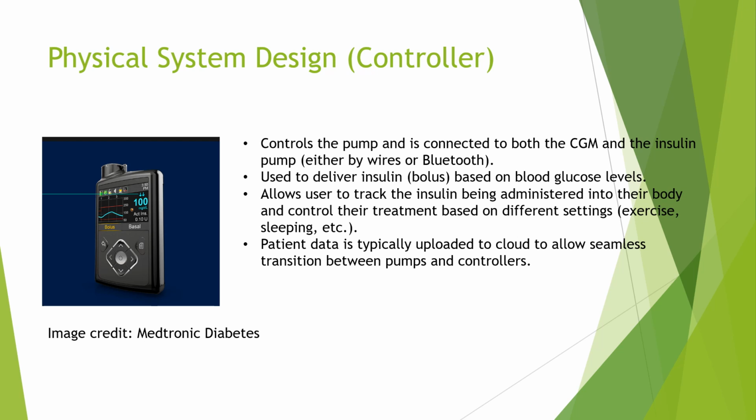The controller is this device. It is connected to both the insulin pump and the continuous glucose monitor, or CGM. It is used to control the settings of the insulin pump and determine different modes and different types of insulin delivery for different types of activities.